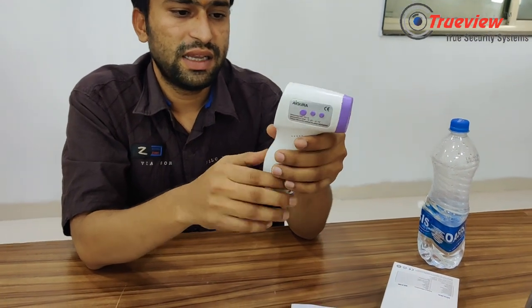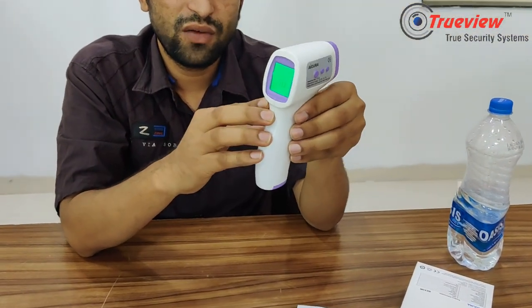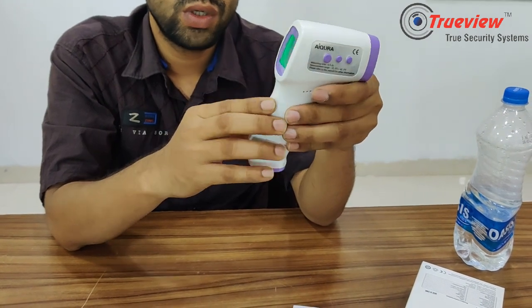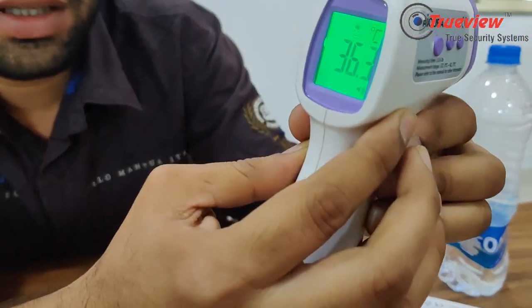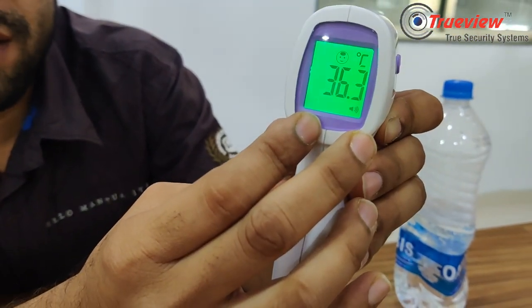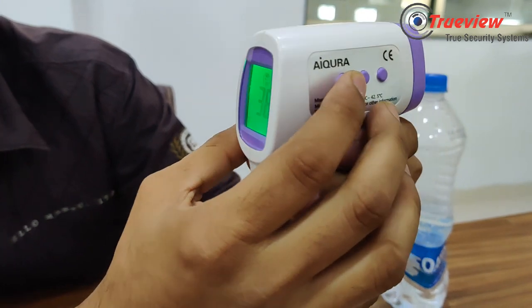Here you can see the degree Celsius and Fahrenheit measurement options. Degree Celsius is the default setting. If you want to switch to Fahrenheit, then you can press the mode button to change the unit.